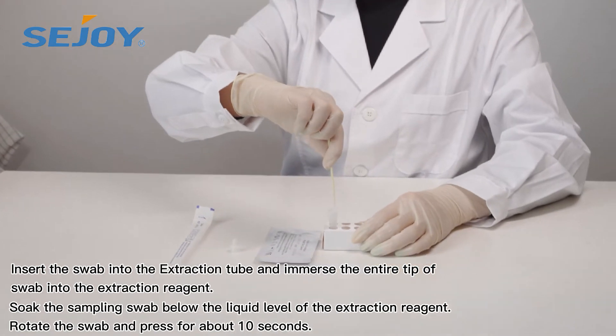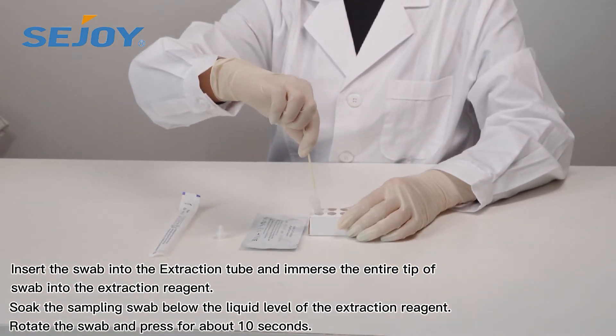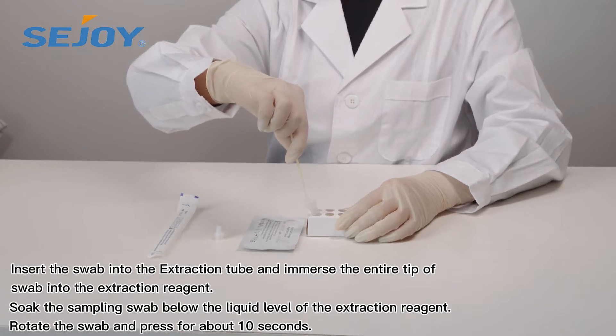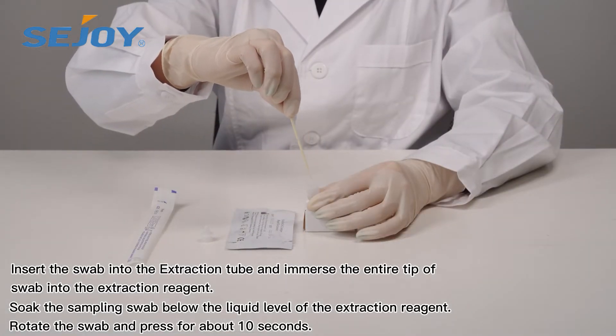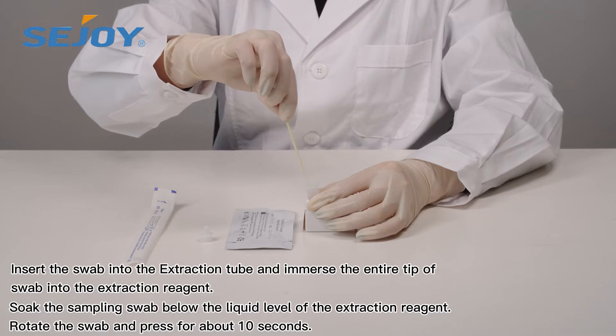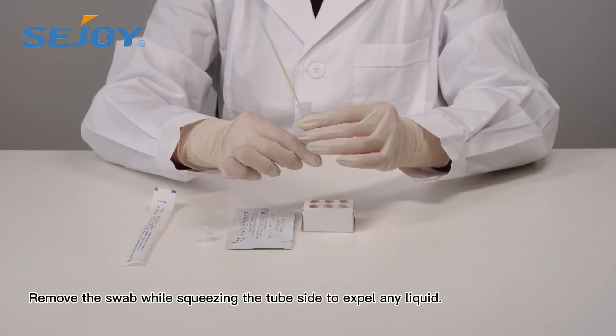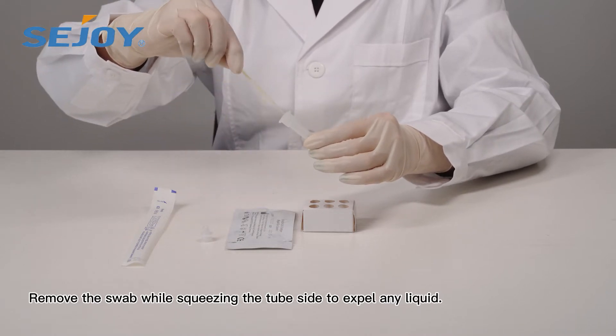Insert the swab into the extraction tube and immerse the entire tip of the swab into the extraction reagent. Soak the sampling swab below the liquid level of the extraction reagent. Rotate the swab and press for about 10 seconds. Remove the swab while squeezing the tube side to expel any liquid.